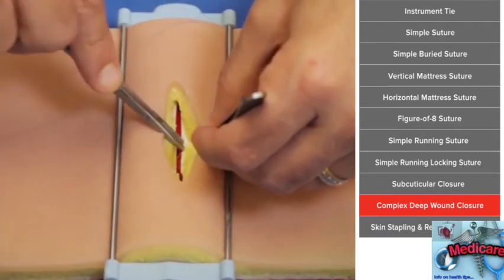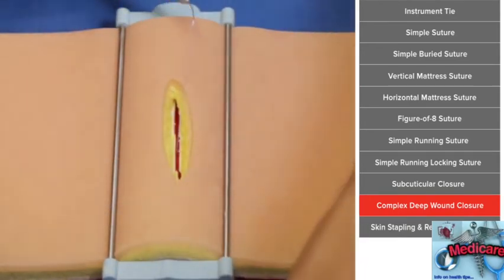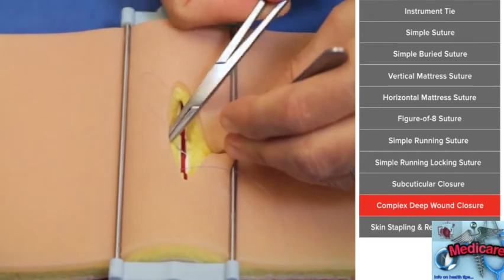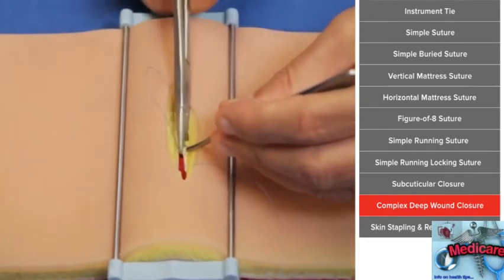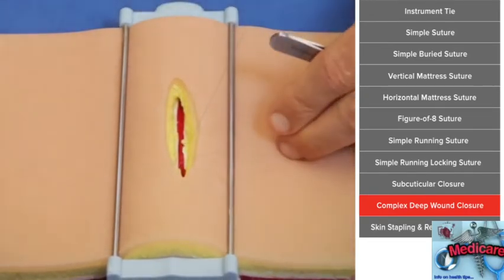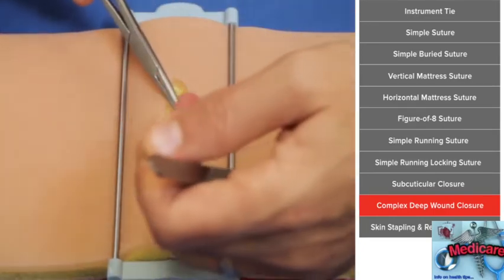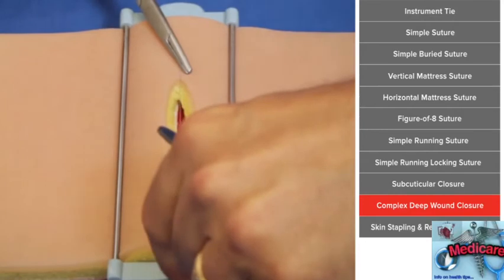Because fascia is generally so deep to the skin, I usually don't bury the knot. You certainly could, but you don't have to. So for simplicity's sake, I just do simple suture here. In some situations, we might use a permanent suture here. Certainly you can use absorbable as well, so it's kind of surgeon's choice.